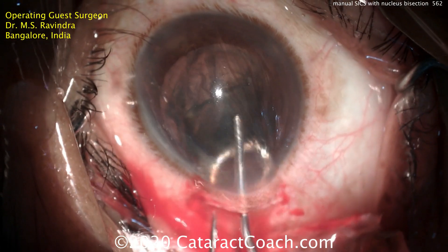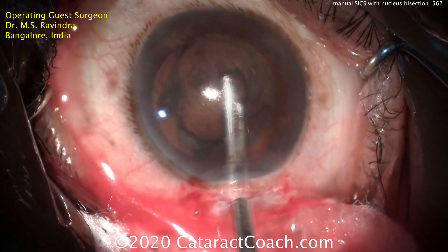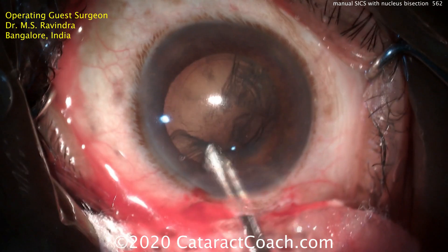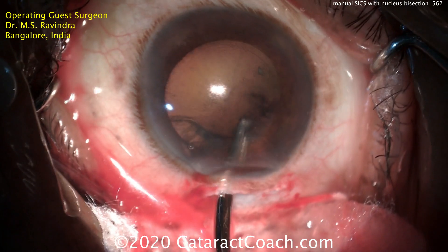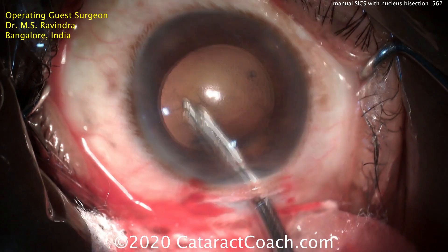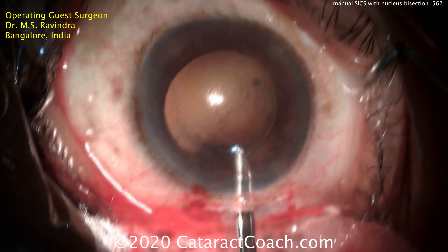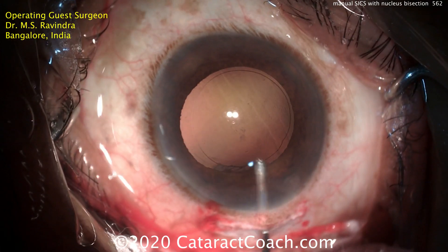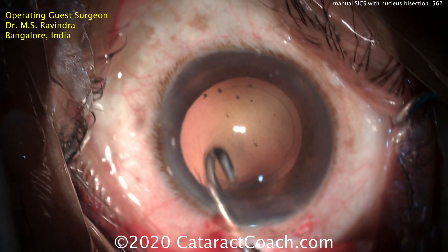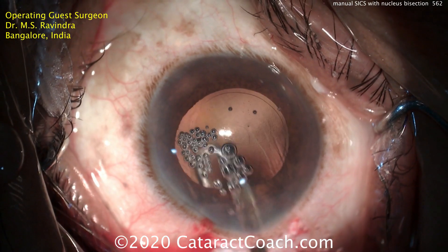A little more dispersive viscoelastic, and he's going to put the vectus back in. Watch how he injects more viscoelastic to viscoexpress that — a really nice technique. He can do a little bit more to get out of that epinuclear shell. This is a very efficient technique, shown in real time. Now using a Simcoe, he's going to remove all of the cortex and clean up the capsule bag. He was very careful not to come near the corneal endothelium, so that's been protected. A J cannula is used to remove the sub-incisional cortex, and that looks perfectly clean.